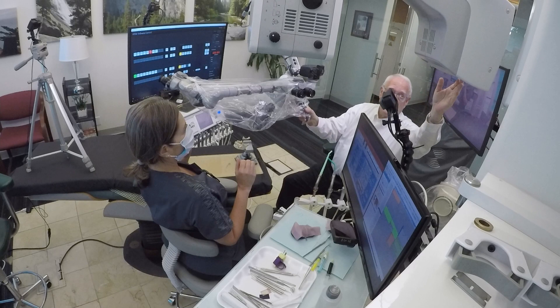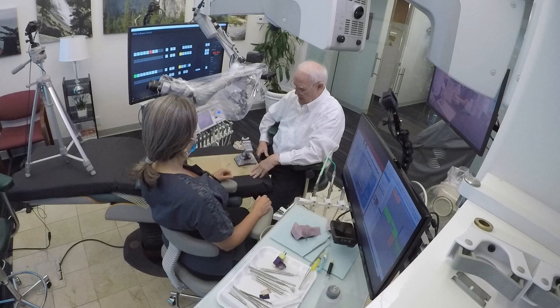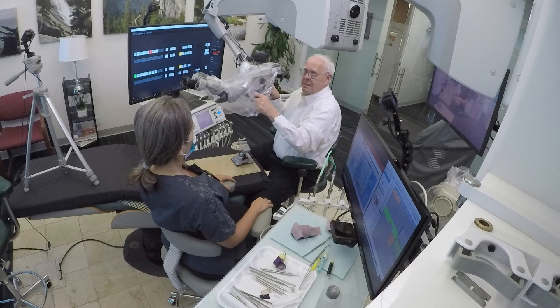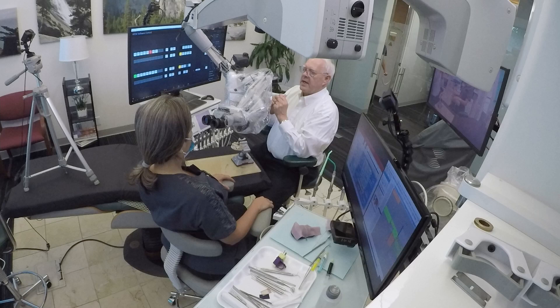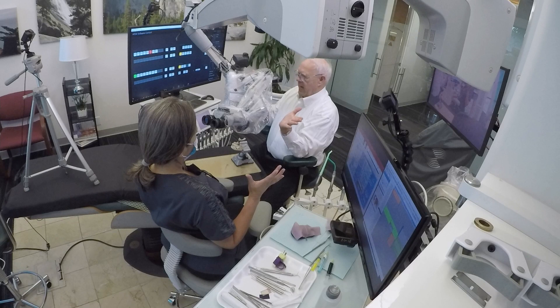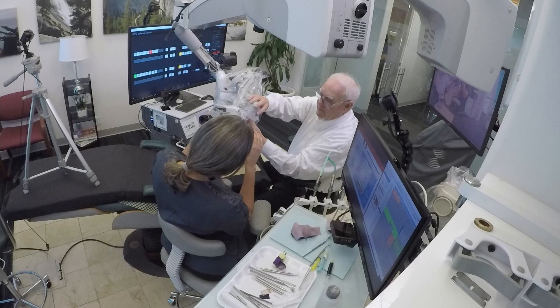The procedure is that I position first, and I get focused, and you're just sitting there waiting. I get position, I focus, I get everything, and then I do a sign. The sign is this — both hands — and I go one, two. That's the sign for you to position this.